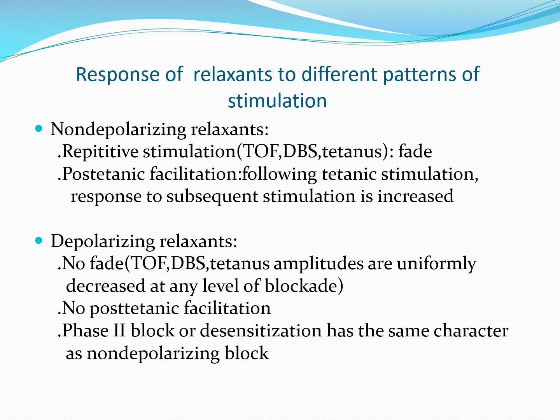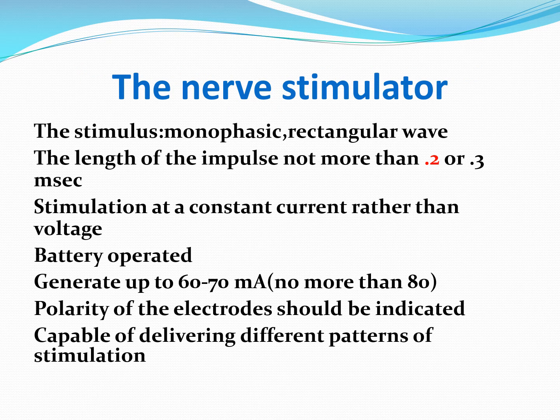An important point is, if the patient receiving succinylcholine repeatedly or by infusion, or if he has succinylcholine apnea, develops phase 2 block or desensitization, it will have the same character as non-depolarizing block. There will be fade and there will be post-tetanic facilitation. These are the characters of nerve stimulator use.